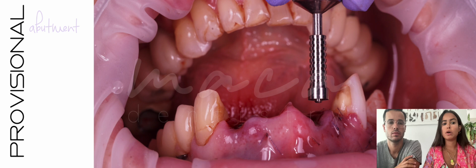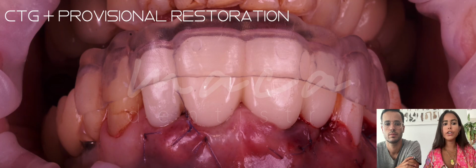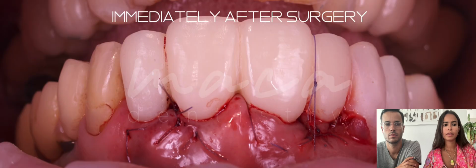Then, in order to obtain our immediate provisional restoration, I attached the temporary titanium abutments over the OMNIs and attached the interim prosthesis to the temporary abutment using tooth-colored acrylic resin. Here you can see the provisionals and the guide. And this is the result immediately after the surgery, already with the immediate provisional screwed in.